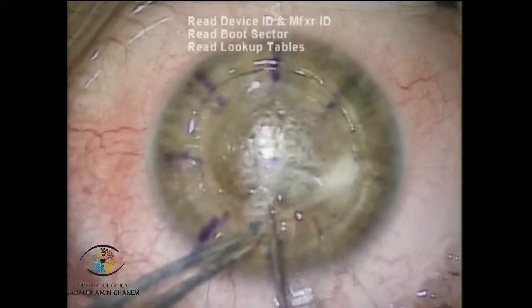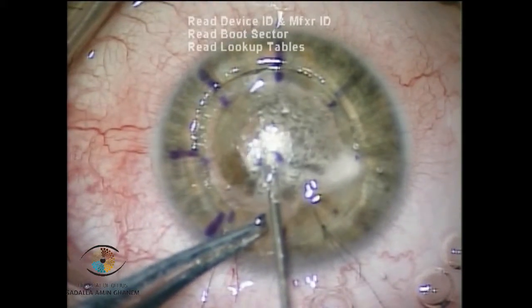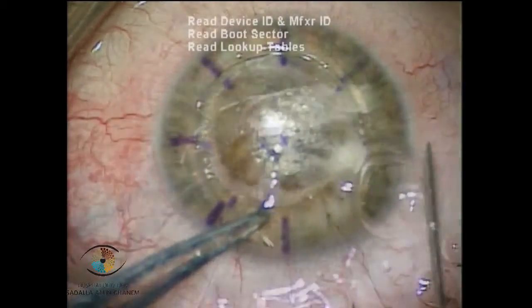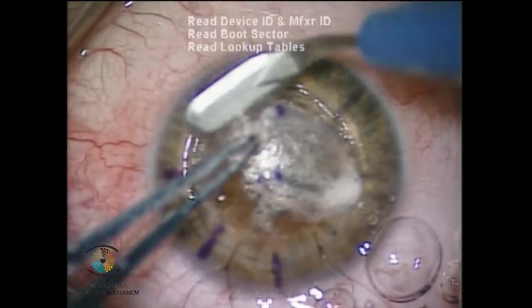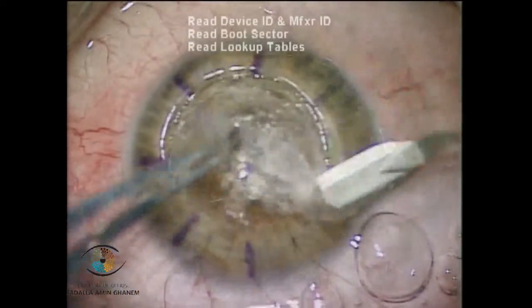This perforation is also a superior one, which is an easier perforation to block by air tamponade. Now I am injecting viscoelastic inside the bubble and removing the anterior stroma.